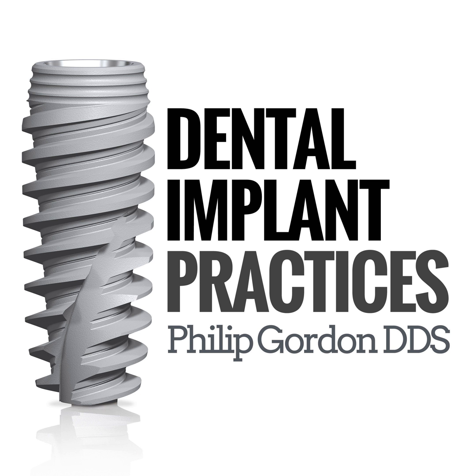And then after 3-4 years of Groovy, especially in the posterior maxilla, I started seeing peri-implantitis that I hadn't seen before. So I called the engineer, Steve Herson. I said, Steve, I'm concerned. I'm starting to see some peri-implantitis in poor quality bone, posterior maxilla. He said, go back to Select. So Replace Select has that 2 millimeter machine collar, which I wanted them to keep.